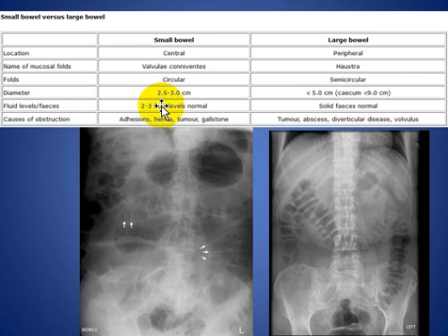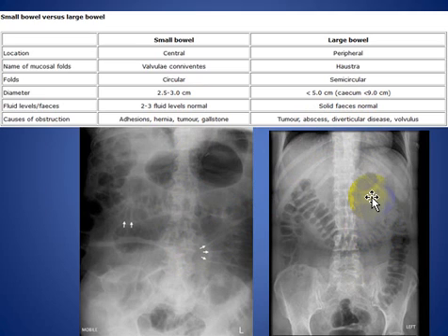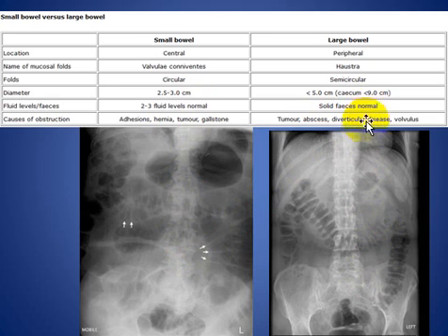Fluid levels: two to three fluid levels are normal in the small bowel. In the large bowel, there is no fluid level, but there is solid feces sometimes mixed with gas. This is normal.